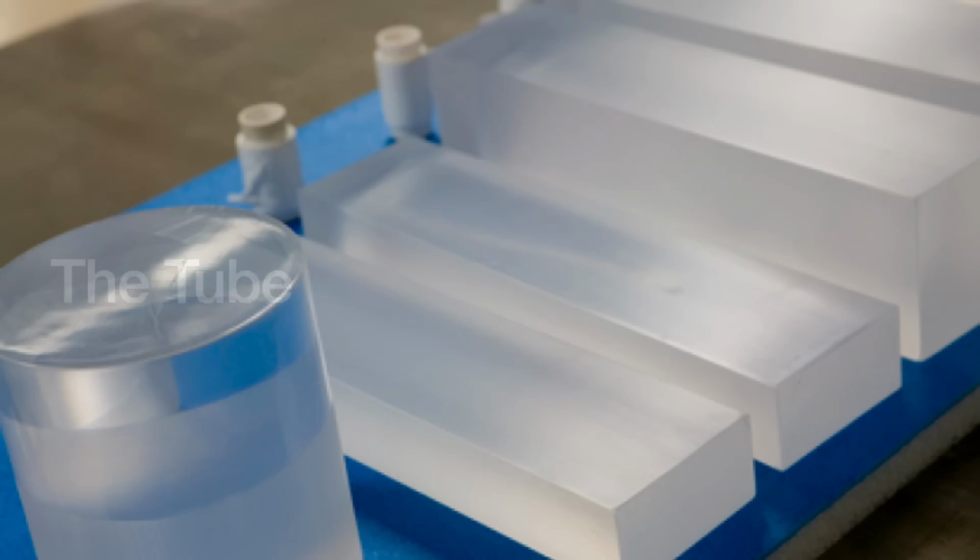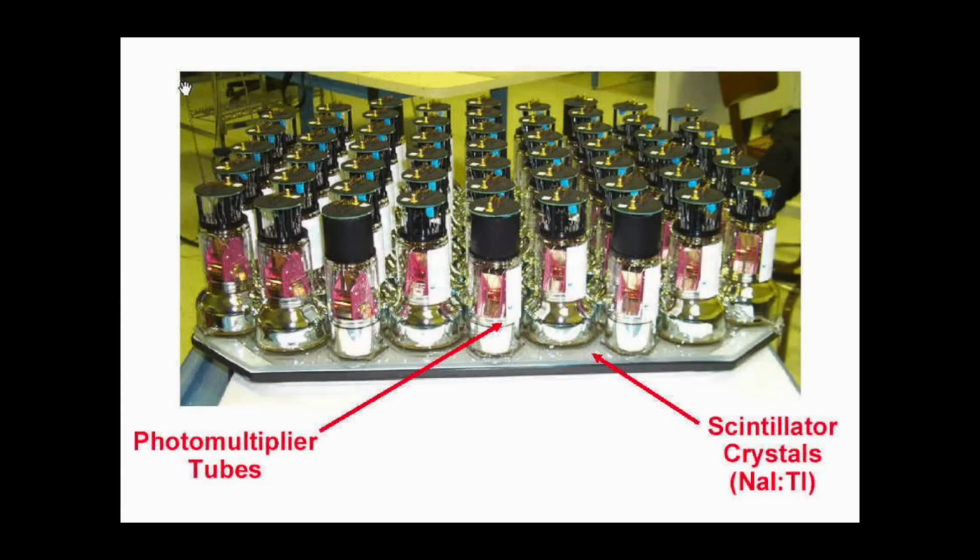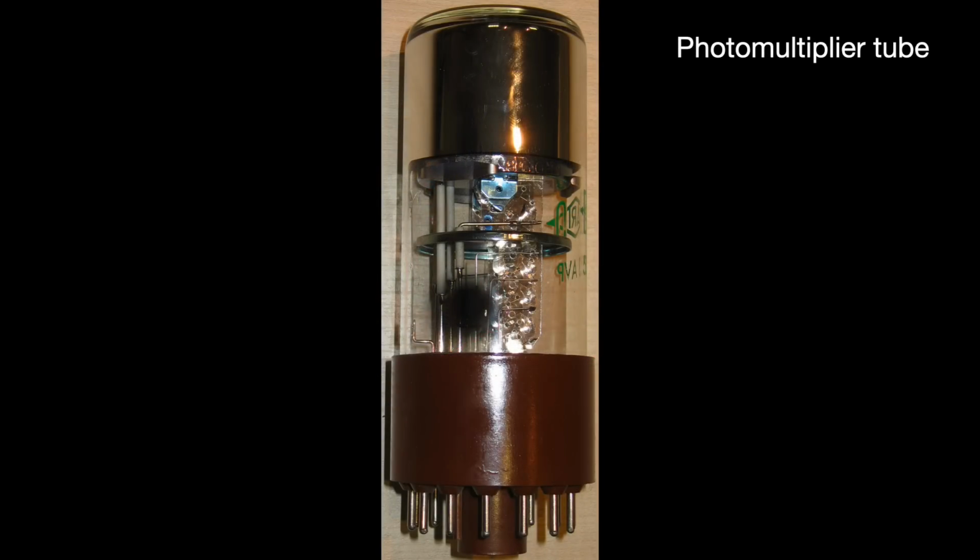The crystal itself is just one half of the odd couple driving our PET scanner. What about the systems detecting the light coming out of the crystal? The scintillator crystals are attached to photomultiplier tubes that multiply and convert the weak scintillation light into electric pulses for interpretation by electronics. These are cheap and extremely sensitive electronics that turn a single photon signal into a significant electric one.